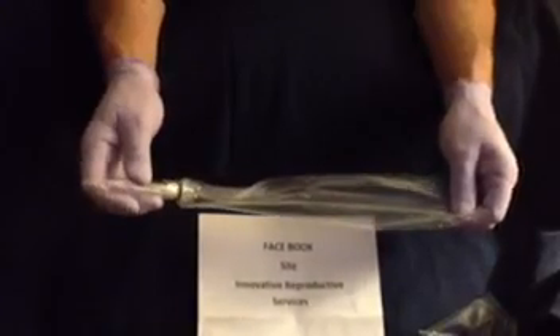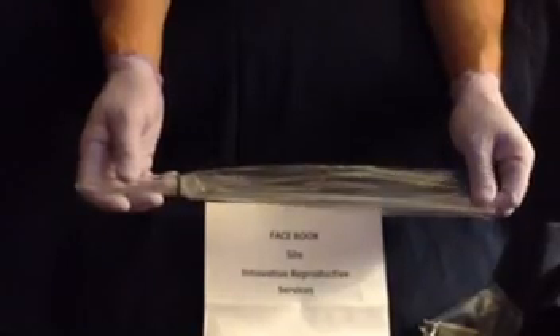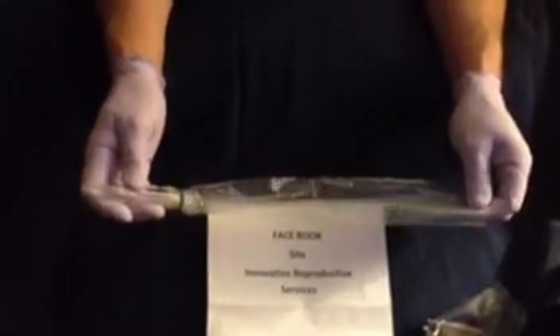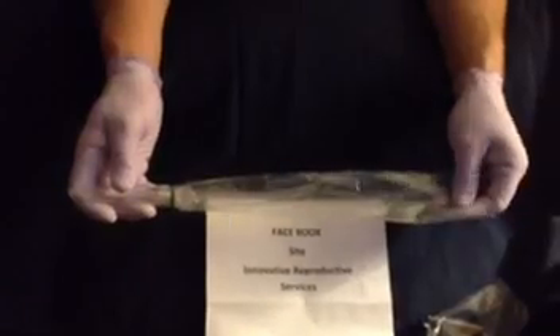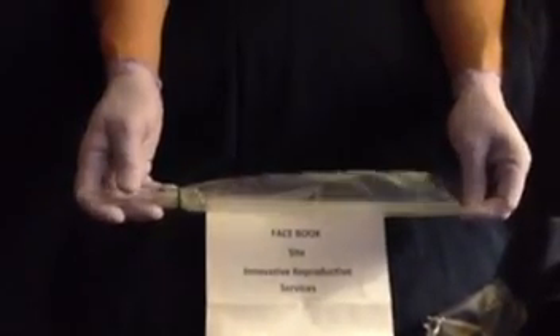What you do not want to use is latex. Latex is spermicidal. Generally people try to wash and rinse them, and there are a lot of residual issues with the type of cleaning solution they use on them. Latex can break up and cause problems within the ejaculate.